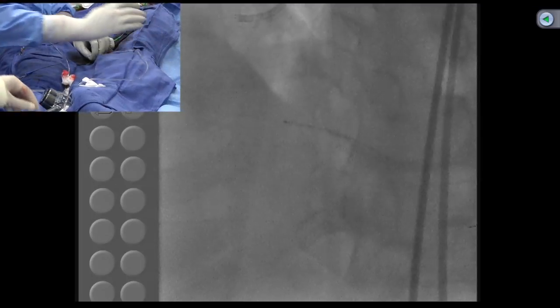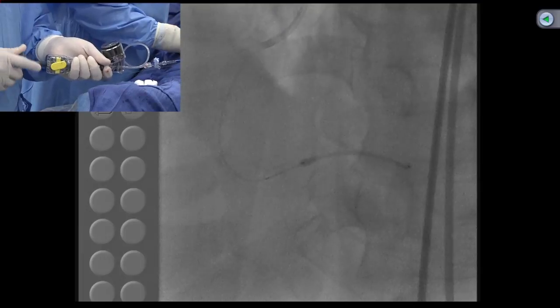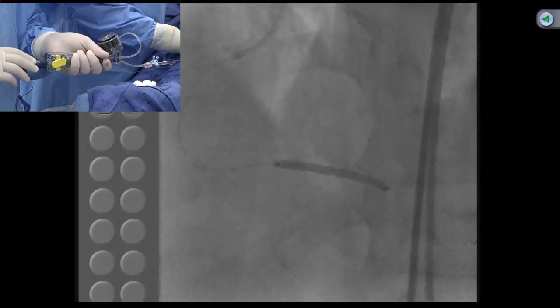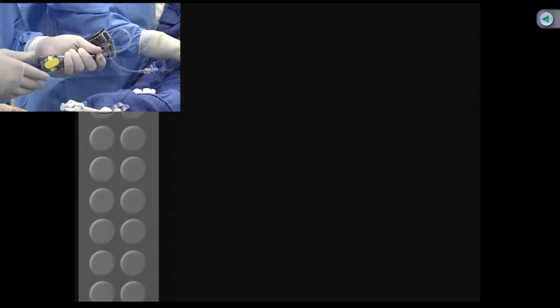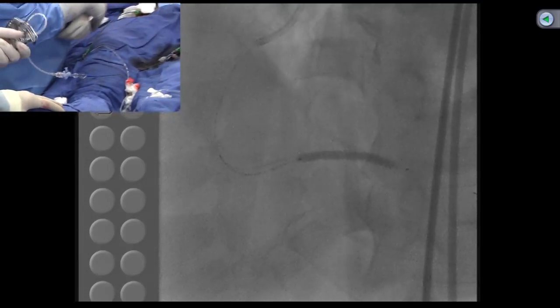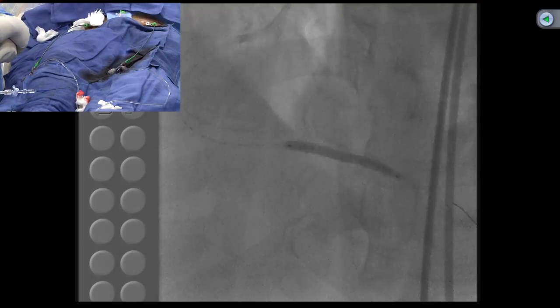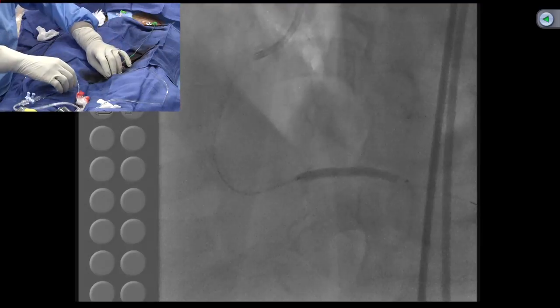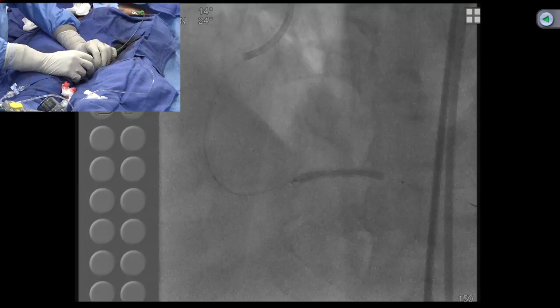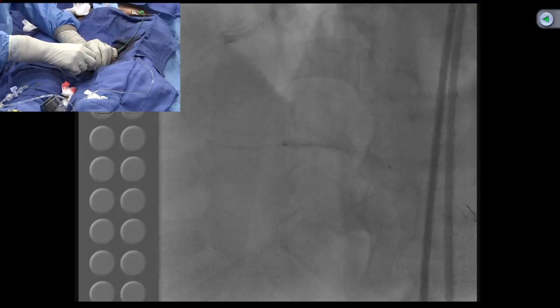Okay. We go up here? Yeah, okay. It's not covered. All right, now 10 atmosphere. Pull the wire a little bit. 12, 14. Down. The 2 inflations. Let us go at 3.5, 3.8. This looks so big. I think we'll leave a 3 only. Yeah. No, but we have opened 3.5, which is moderate pressure, will be okay. We have opened it. Yeah. No, but it's a big vessel. I think it will plump up with the nitroglycerin because we saw such a big one.